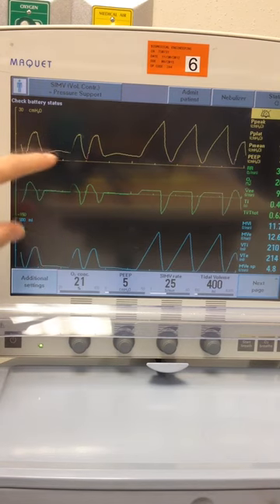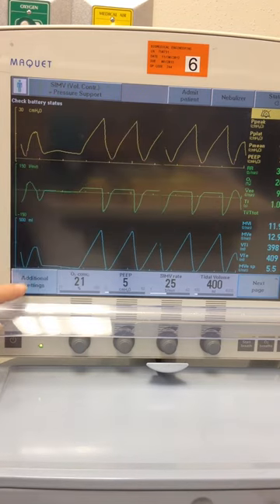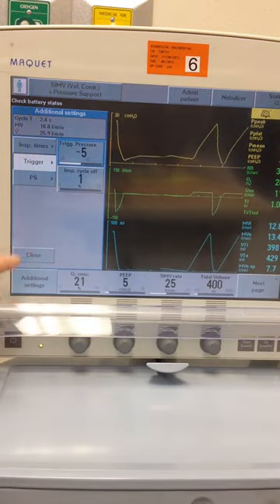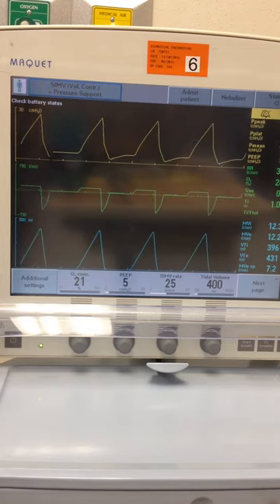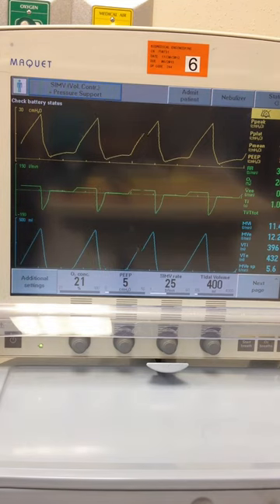Again, it looks like we're auto-triggering — our rate is above 25 — so let's change our trigger again. Now look at our peak pressure: 27. That's a pretty significant jump. Our volumes are still 395, right at that 400, which is exactly what we want because we're in a volume-controlled mode.